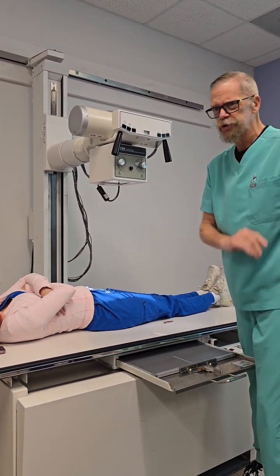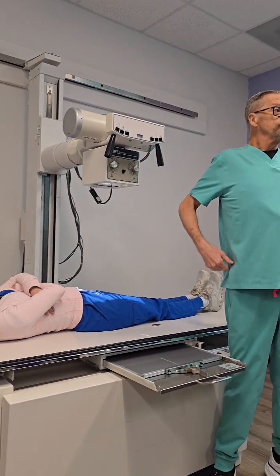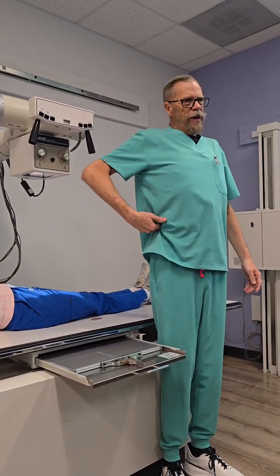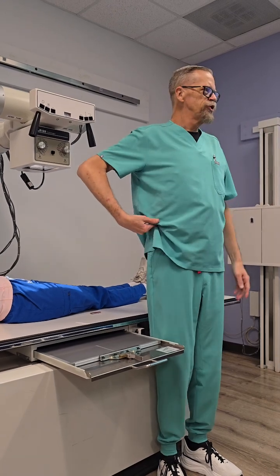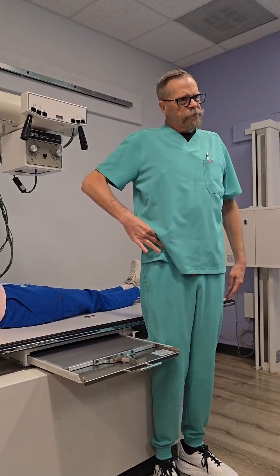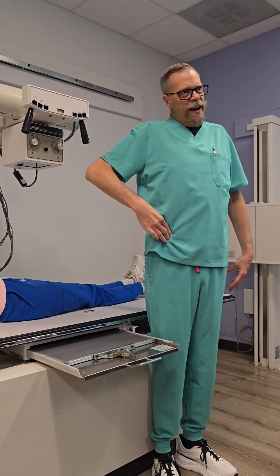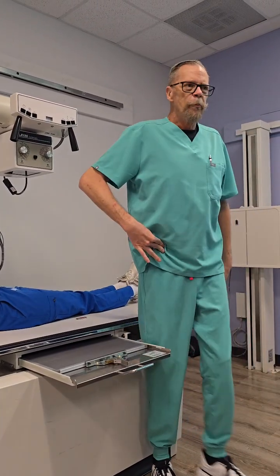Where do we want the top of our image receptor? At the ASIS. So for those of you that are new and don't know what the ASIS is — if you palpate the top of your hip bone and come anterior, you feel this little bump that sticks anteriorly — that is your ASIS. If you find the top of the pelvis, which is called the iliac crest, follow it anterior and there's going to be another bumpy bit. That is your ASIS.